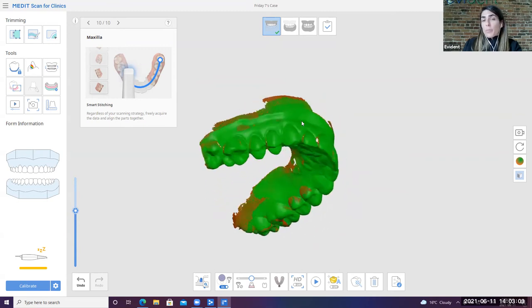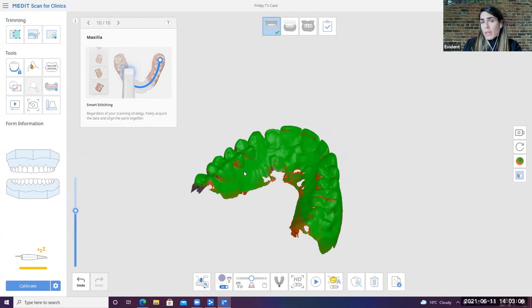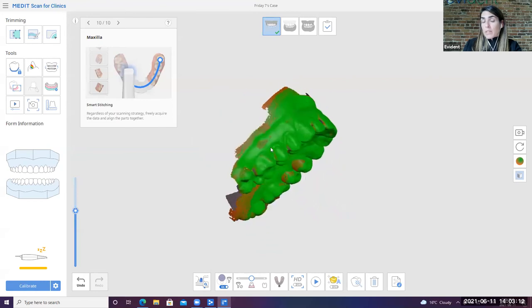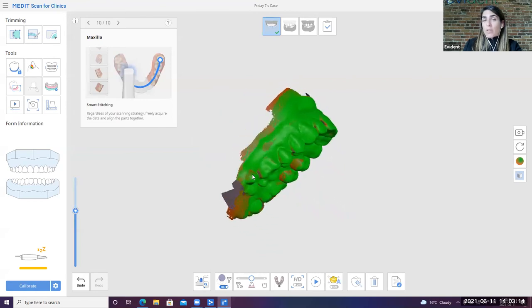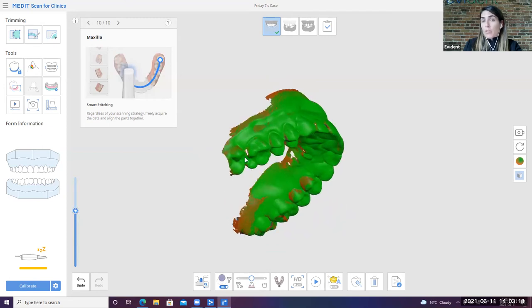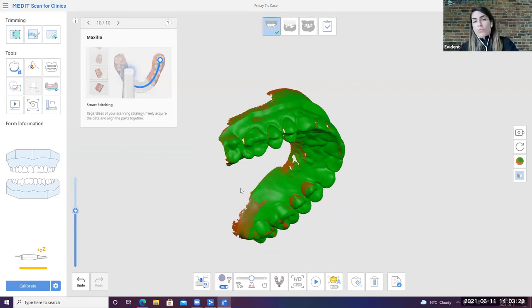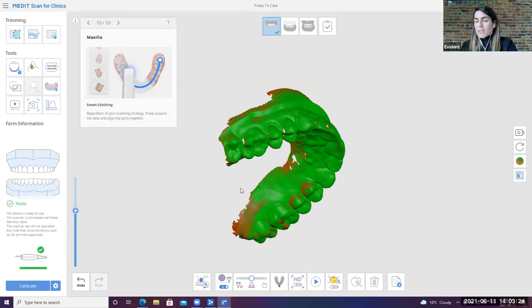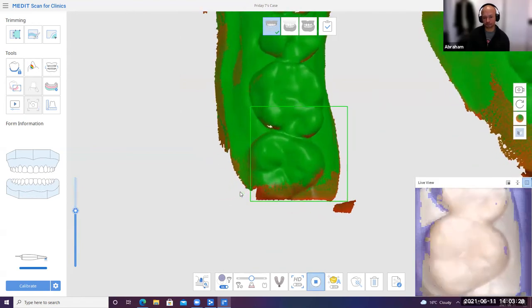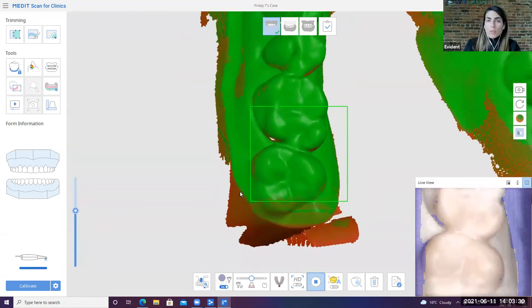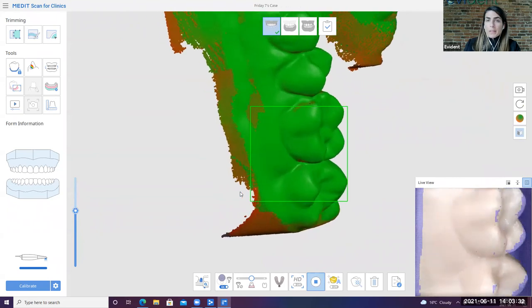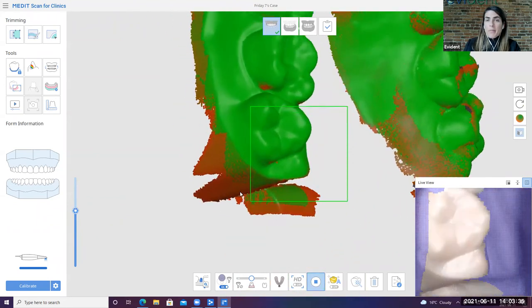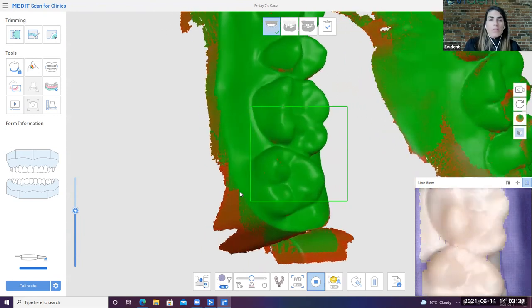So for the purpose of the demo, the majority of this stuff is all okay. I just need to make sure that in my areas or in my bite markers, so to speak, that I capture enough data to be able to register that bite properly. So I try to have two to three millimeters of gum in there and I try to ensure that my interdental spaces are well captured. So I got to get a bit more and then I have complete occlusal shortages. So I'm just going to quickly fix the rest of the scan here and then you can move to the lower. So I find my occlusal marker and then I just fill that up, make sure that I capture it all.